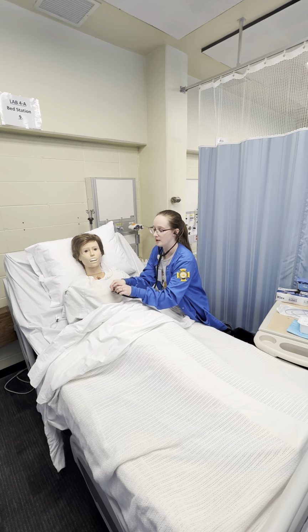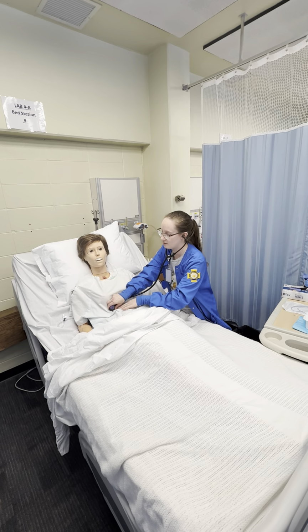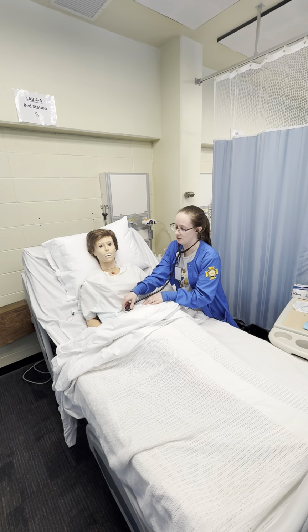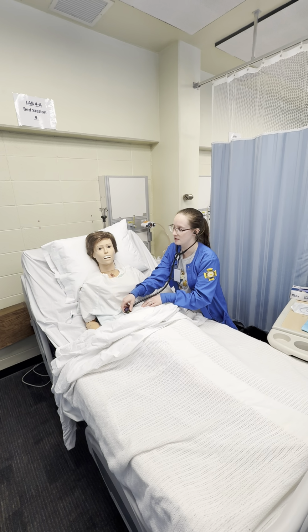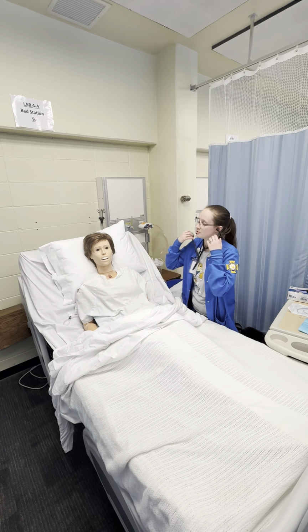And then when I go to listen to their abdomen sounds, I also want to be assessing their abdomen for any signs of distension or other problems. If it was evident that there was some distension, we would just get a circumference measurement on the abdomen. But my patient's fine, sounds were all good, there was no distension.